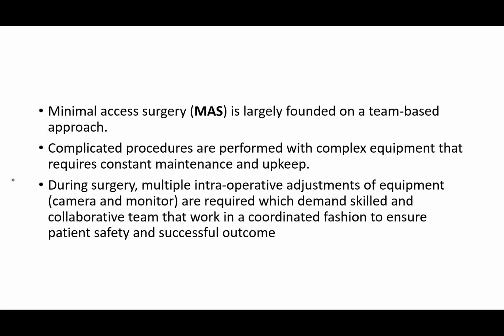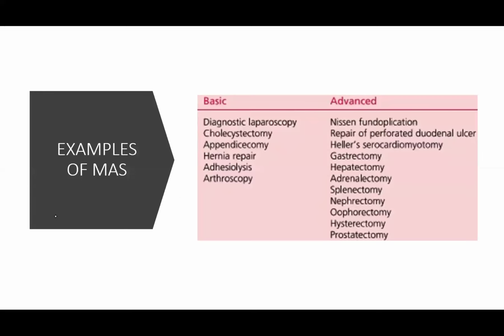Imagine you want to do laparoscopic surgery, you are looking for the telescope, it's nowhere to be found. The cable is missing, no suction tube. Your assistant is not around. The entire process becomes frustrating. Now, it must be teamwork that is done in a collaborative manner.